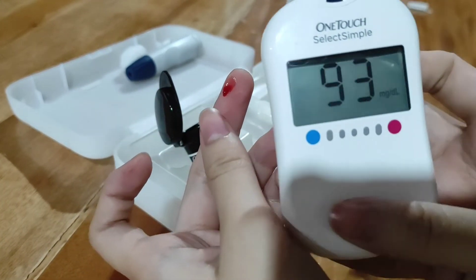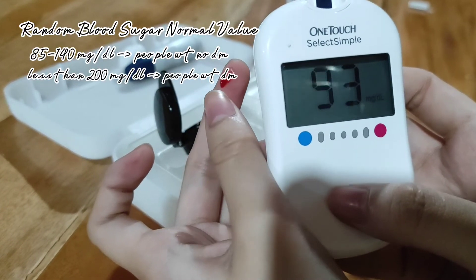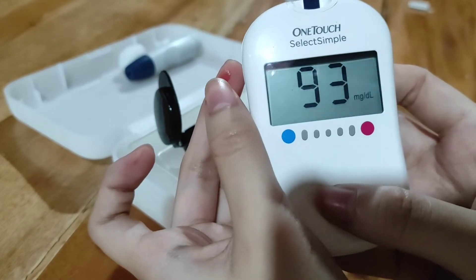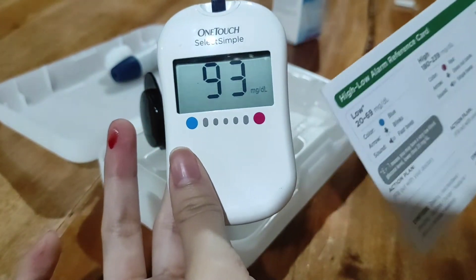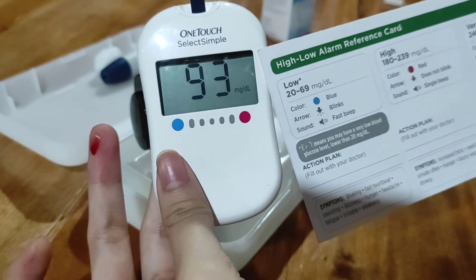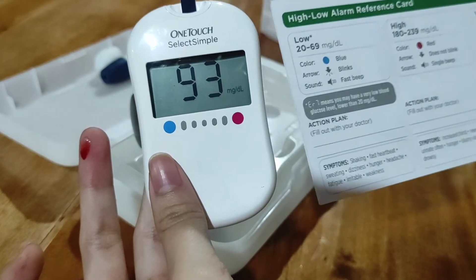As you can see, nag-read na ang glucometer and it says 93 milligrams per deciliter. That's how we use our glucometer — 93, not low, so normal lang tayo.